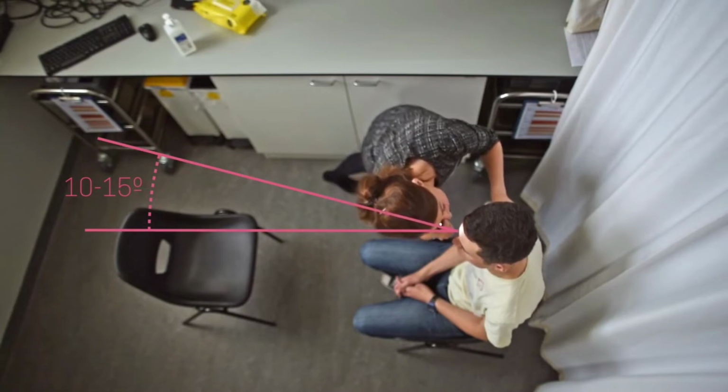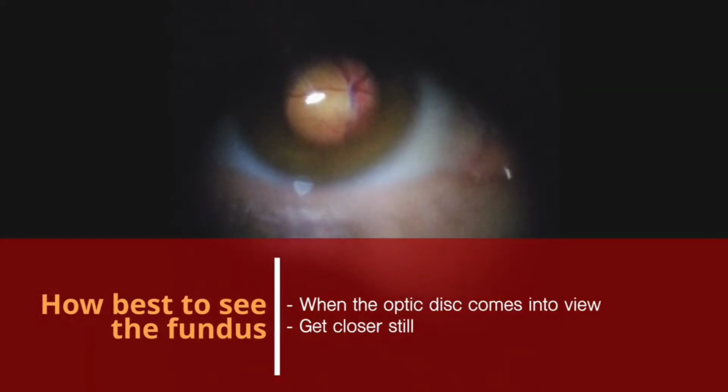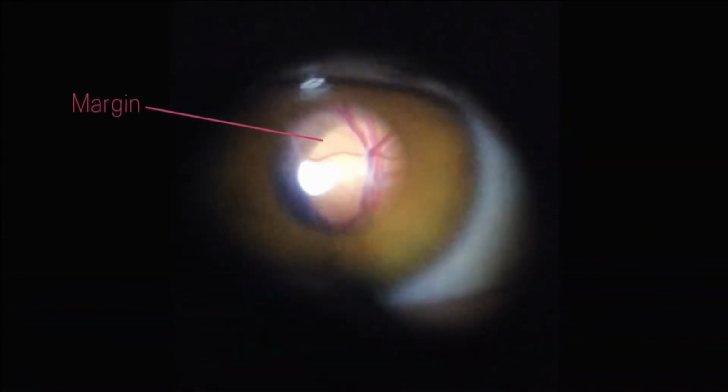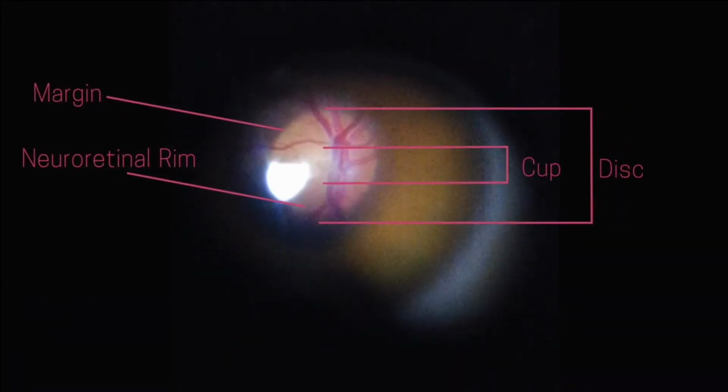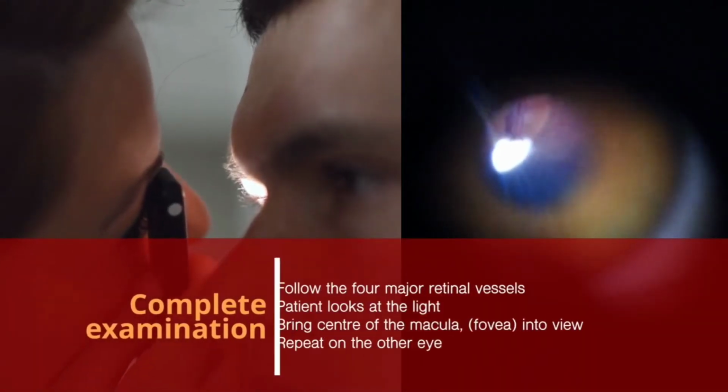When you're close to the eye, the optic disc should come into view. Go in closer still and you will get a wider and more stable view. Comment on how distinct the margin of the disc is, the colour of the neuroretinal rim and the cup to disc ratio. Then look for other signs along the 4 major branches of the retinal vessels.